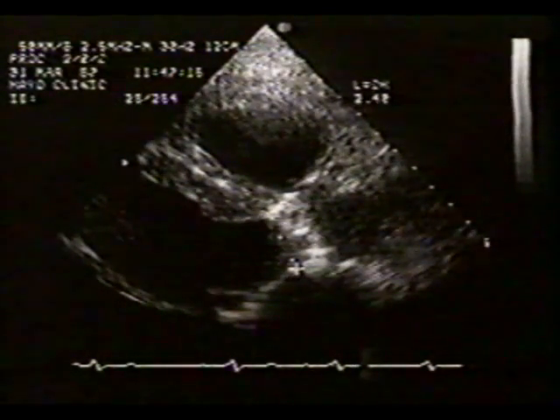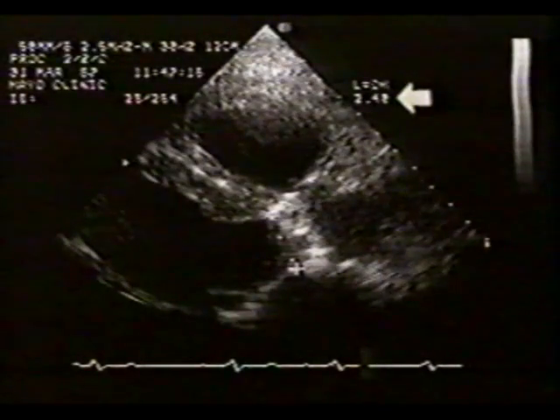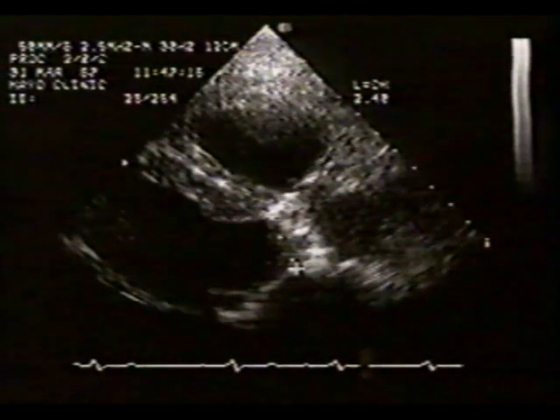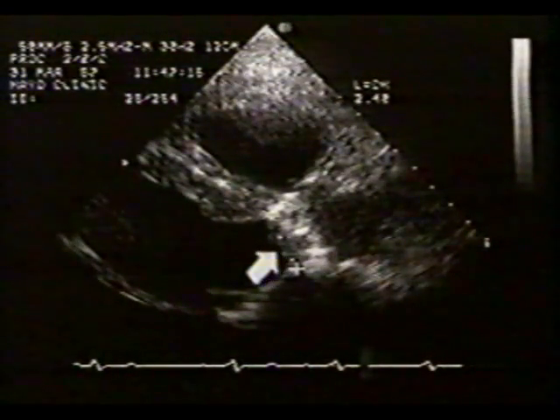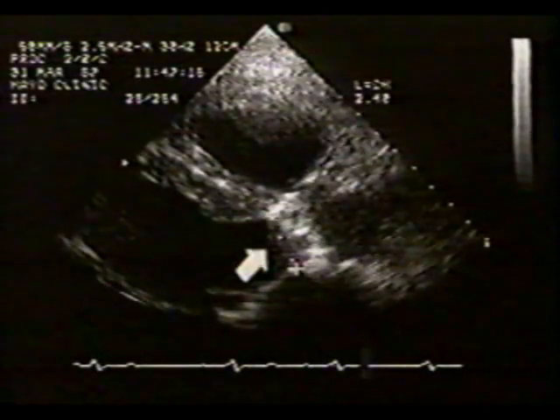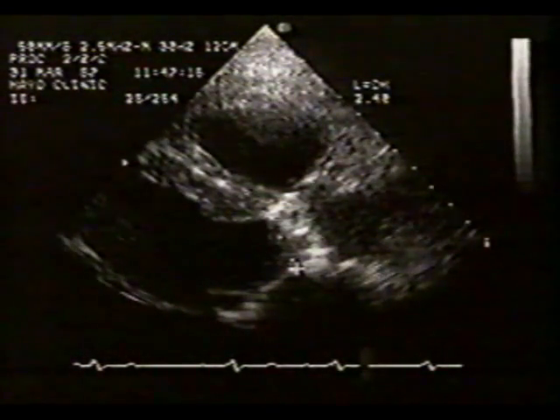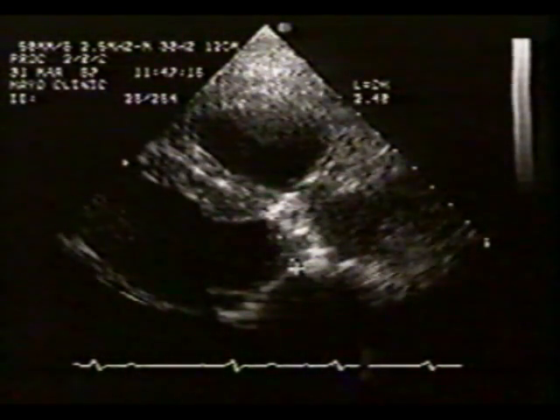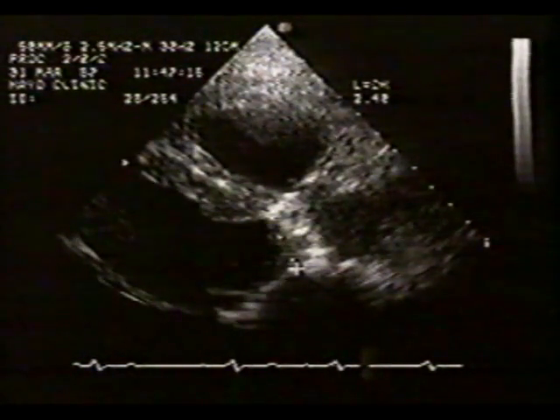In this case, the left ventricular outflow tract diameter measures 2.4 centimeters. As you can see, the LVOT diameter can vary significantly from one patient to another. Remember that any errors made in the diameter measurement will be squared in the valve area calculation. It is a good practice to average the LVOT diameter from measurements on 3 separate beats.